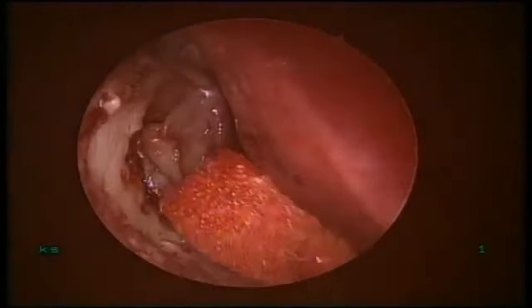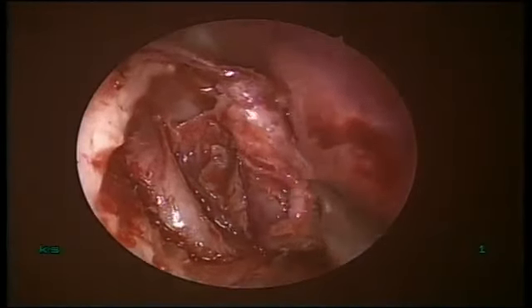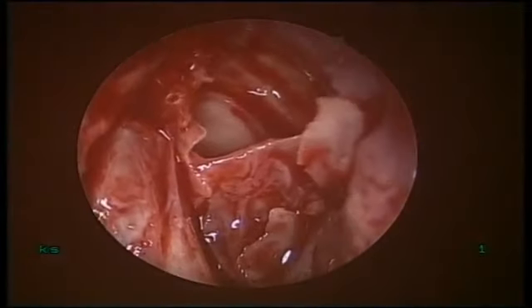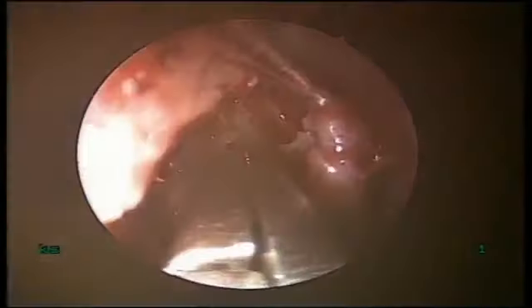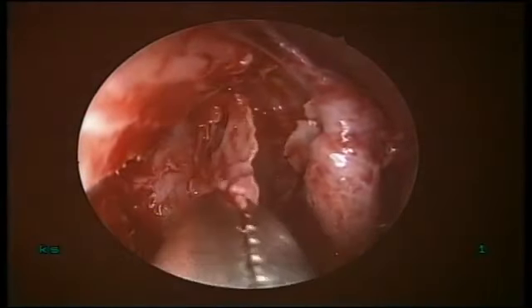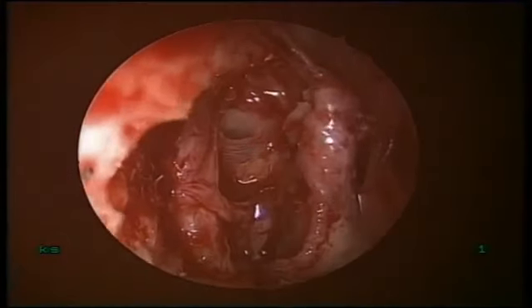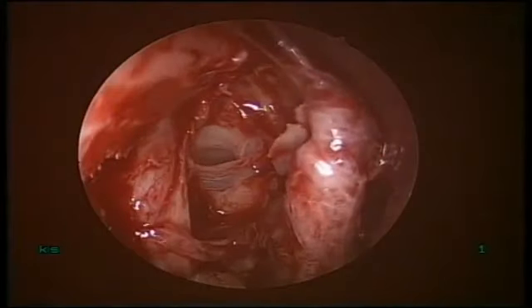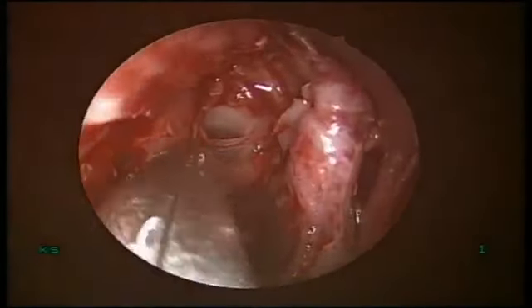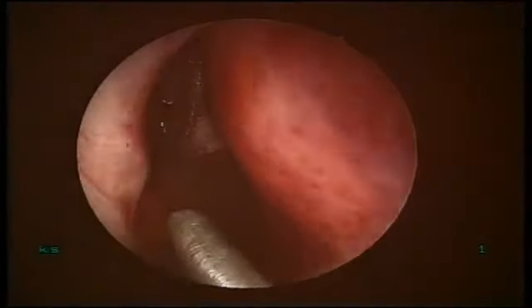You can see. I have done. See the superior exposure. Yes, I have gone up to the superior part of the sac. That's what I told you. See, I have gone to the upper limit of the agger. Can you see? See this entire system more than 2 centimeter in length. See this? It's completely marsupialized.